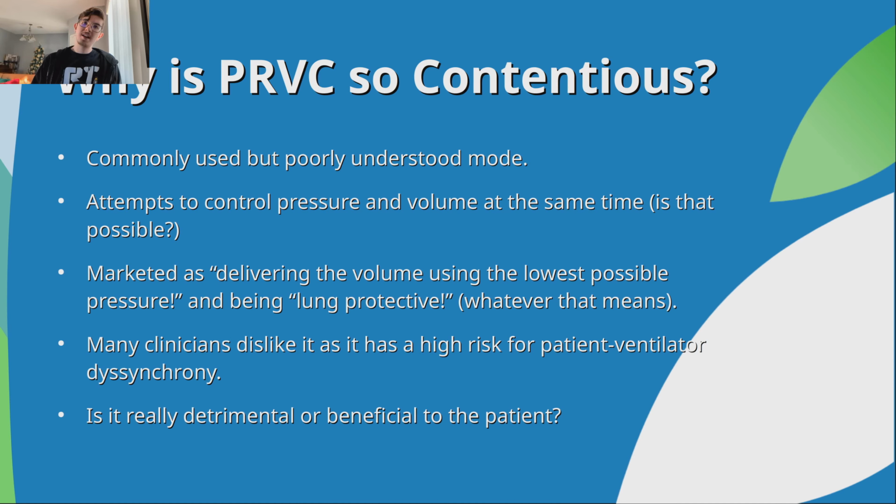So I said at the beginning of this video that PRVC is kind of a point of contention for a lot of people. So why is PRVC so contentious? Well, it is commonly used but poorly understood as a mode of ventilation. What the ventilator in PRVC is basically trying to do is attempting to control the pressure and the volume at the same time. Now, is that possible based on what we just learned about? I want you to think about that.